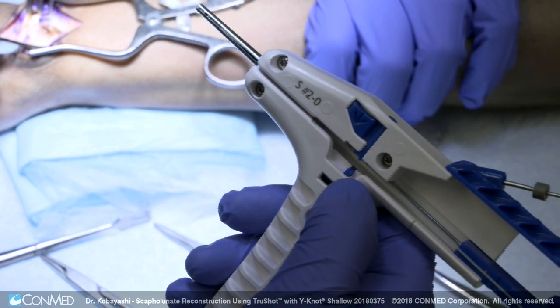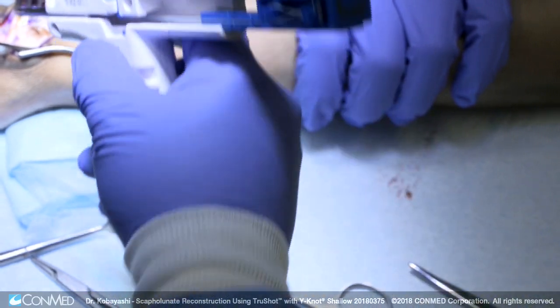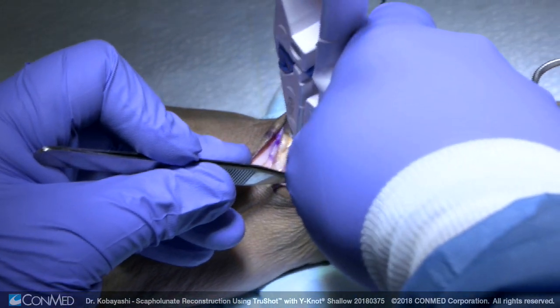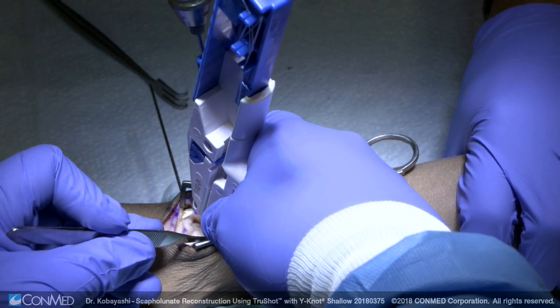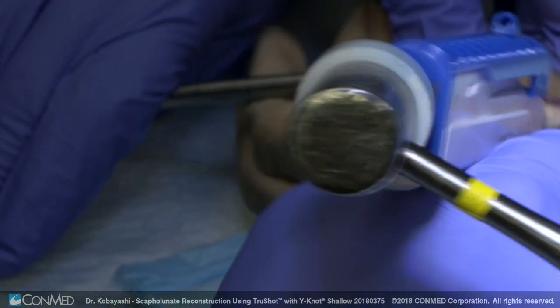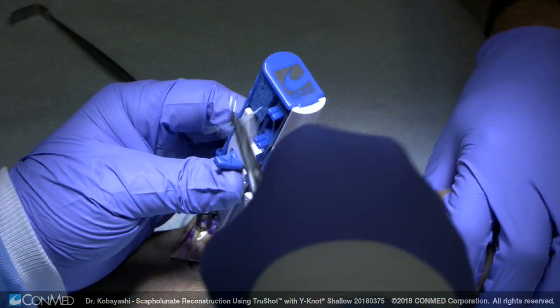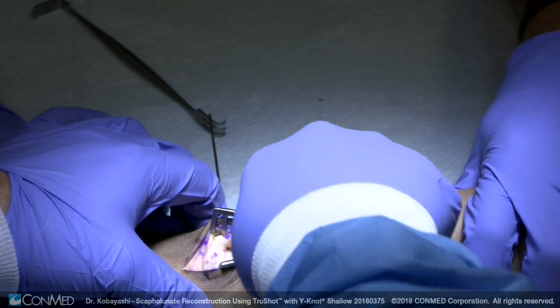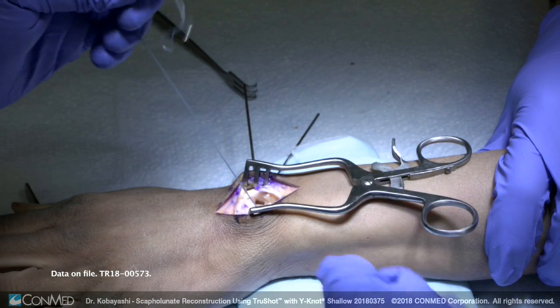This is a TruShot Y-knot shallow. This will penetrate 10 millimeters, so we're going to put that right on the dorsal aspect of the lunate right here. Make sure you're not in the mid-carpal joint. The technique is to drill the pilot holes and then completely remove the drill bit, mallet right to that stop, and then deploy it with the single lever trigger. Take the sutures out. As you can see, that's solid in there — very nice fixation. Pull-out strength is incredible.